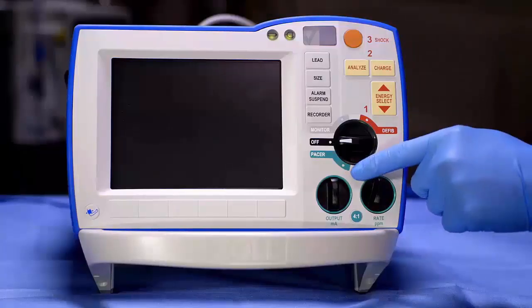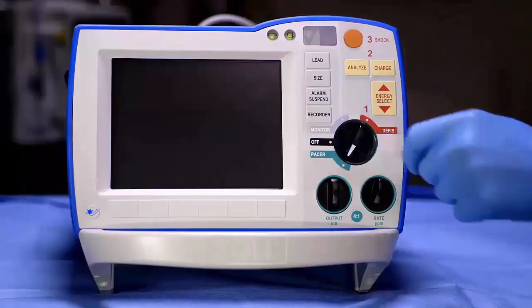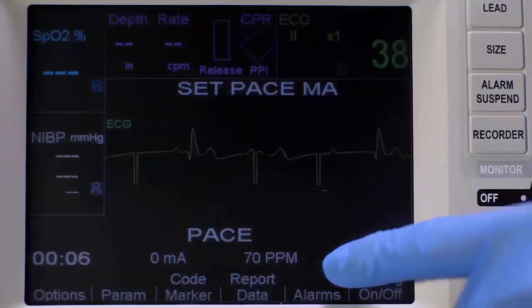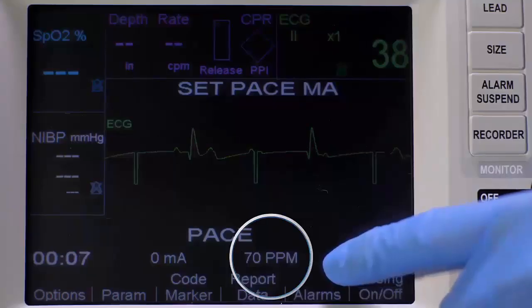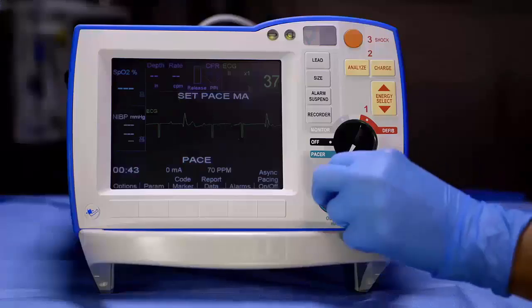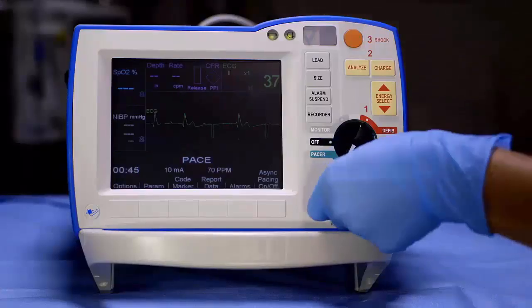To begin pacing your patient, turn the dial to Pacer. The downward spikes indicate pacing pulses. The rate will default to 70 pulses per minute unless your institution has configured it otherwise. Next, increase the output by turning the dial clockwise.